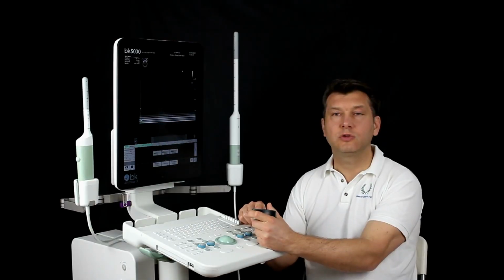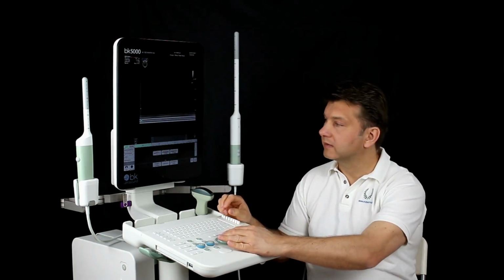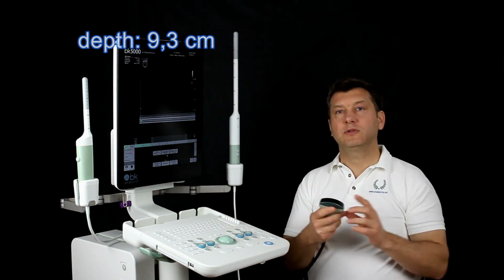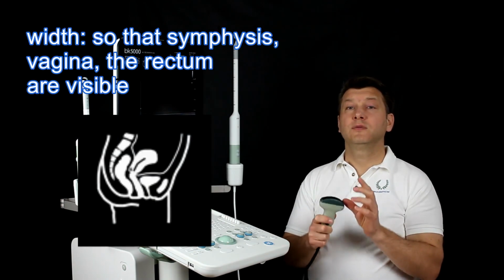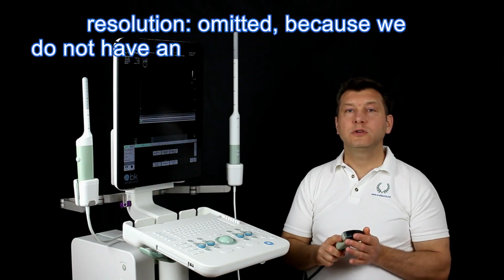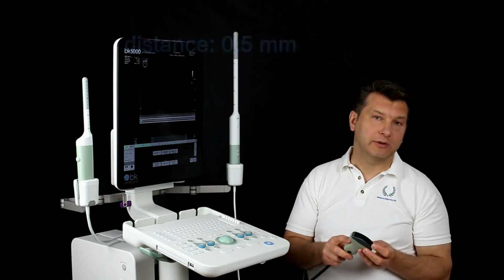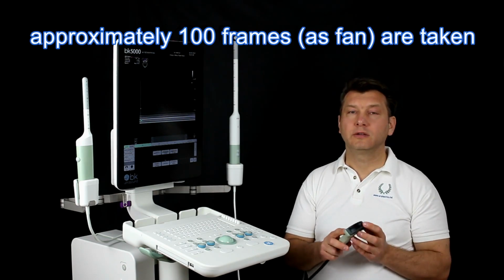What values should we choose here and why? We start with frequency and select 6 MHz. Depth 9.3 cm, which has been proven very well. Width so that symphysis, vagina and the rectum are visible. Resolution omitted because we have no rotation in this transducer. Distance 0.5 mm. Time 5 seconds, approximately 100 frames are taken as a fan.